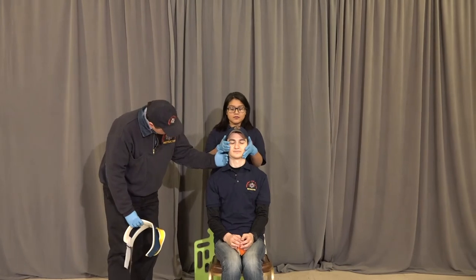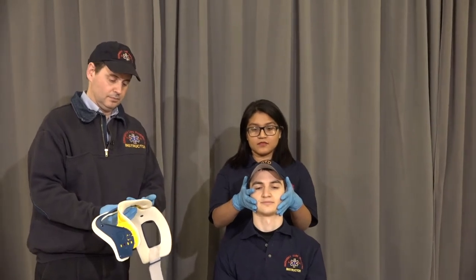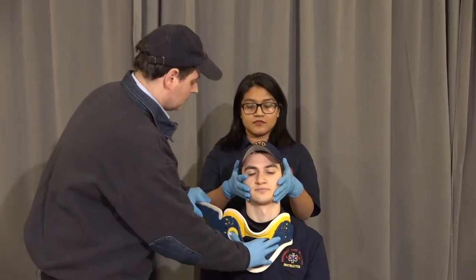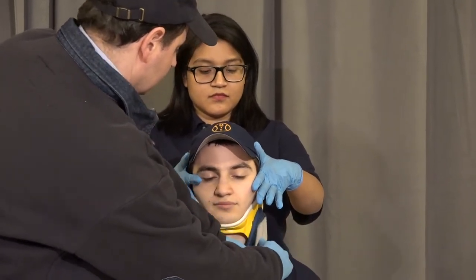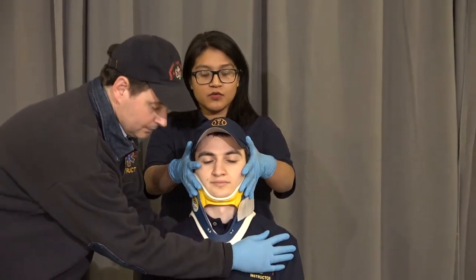Going to measure for collar, sliding it up and under the chin. Fan your fingers out please, making sure it's nice and centered. On the count of three, we're going to move them forward. One, two, three.